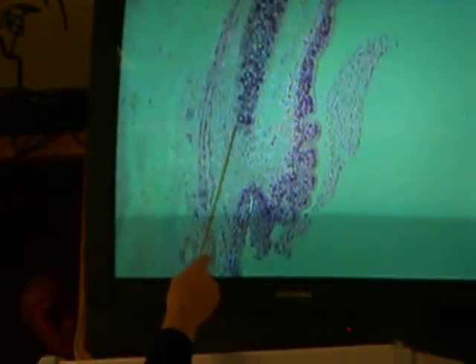And so now, go ahead and show us, this is the end of one side of the C ring. Go ahead and slide down so we can see the other side of the C ring. So we can see it's there, but that in between is a bunch of smooth muscle. There we go. So keep scanning down until we start to see cartilage. Keep going, keep going. There's good trachealis, but keep going. Still no cartilage, right? Keep going, keep going, keep going. Eventually there's the tip of the new cartilage. Keep going down. See the island of cartilage there?